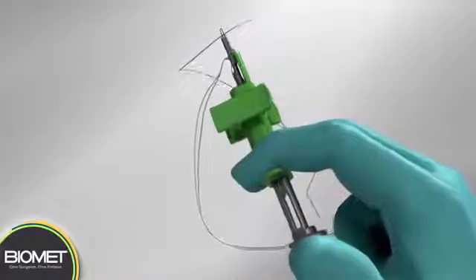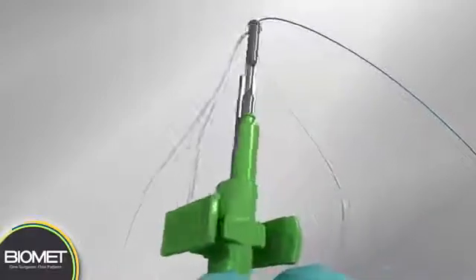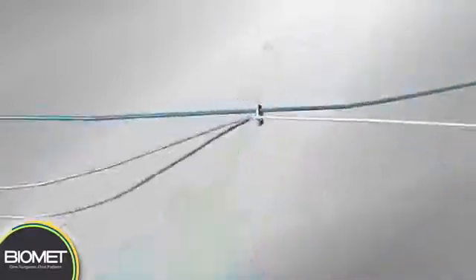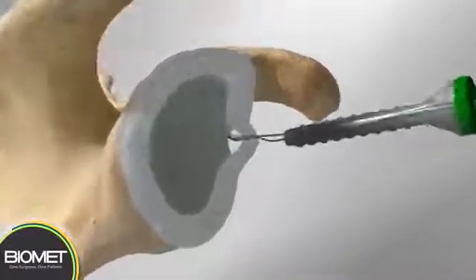Deploy the noose assembly by actuating it like a syringe over the solid blue strand. The noose will slide over and down the solid blue passing strand until it reaches the repair site and fully closes over the tissue.